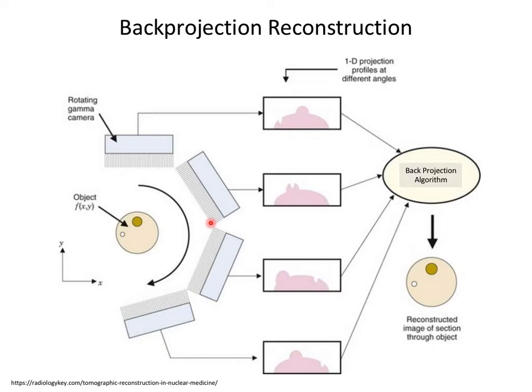So if I inject, say, 10 cc's of a contrast agent into a patient, and we look at the picture and it's kind of noisy because they're big and a lot of the photons are getting absorbed, how would I increase my signal to noise by a factor of 2? If I'm going to do it again, and I know ahead of time, what would I change to crank up my signal by a factor of 2? I would inject 20 cc's. So just put more stuff in.